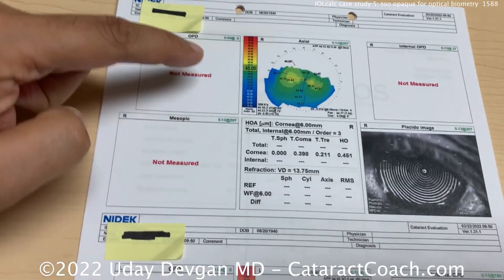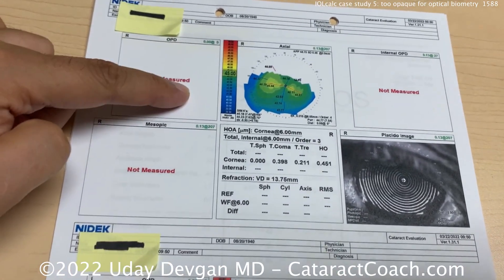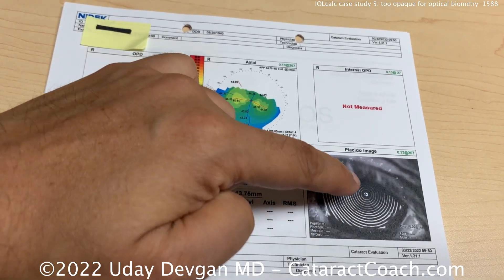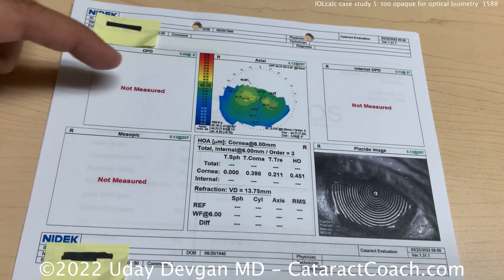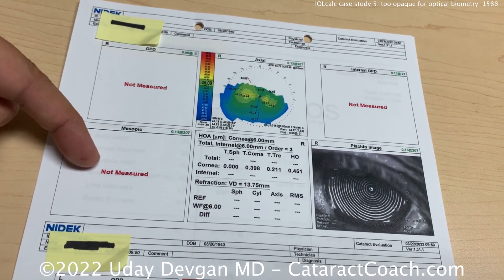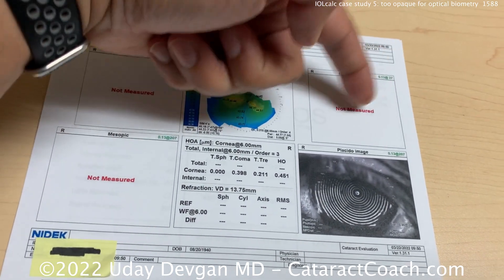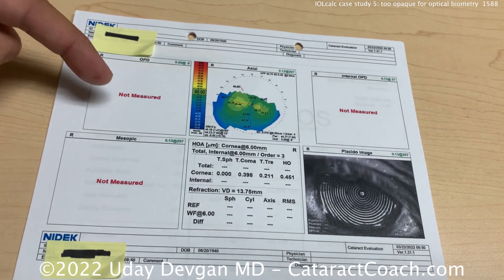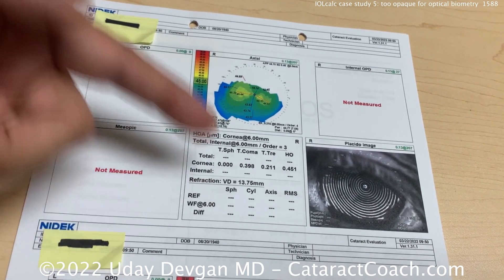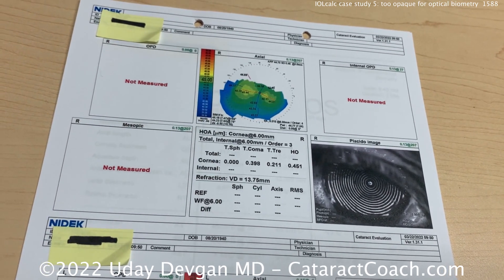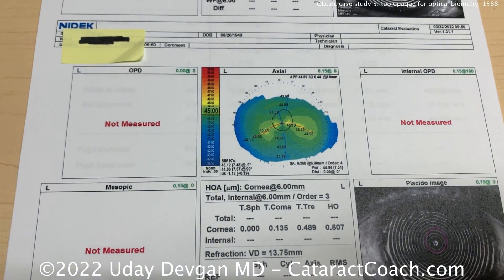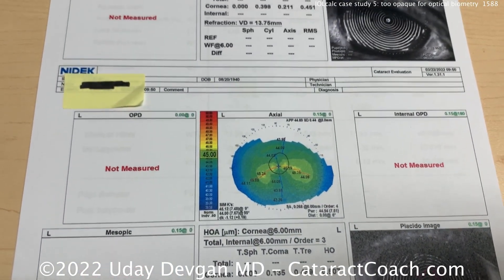Look at this patient. You put him on the autorefractor, get a topography — there's a little bit of ptosis, but the machine is unable to read a lot of things. It can't measure inside the eye, can't measure the refraction. There's no autorefraction. Same with the other eye. This patient has bilateral, really dense opaque cataracts.